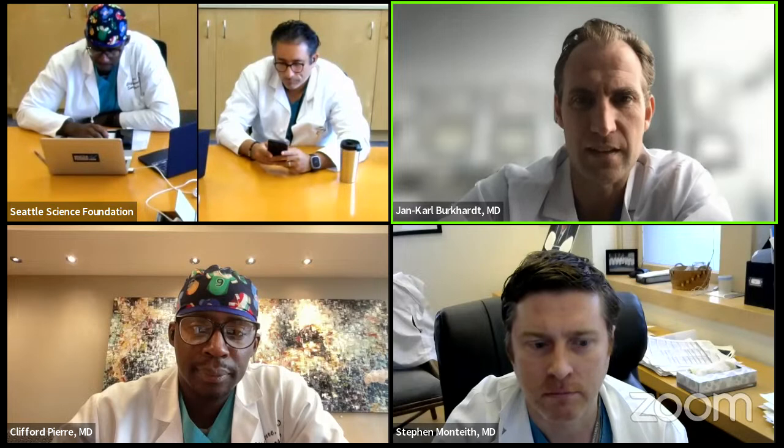For bypasses, sometimes if we don't have an A-line set up, I just put the sheath on a flush line of heparinized saline, and I let it drip very, very slowly. Some people even give heparin anyways during bypasses, so I think that's fine. I'm not super worried about the heparin necessarily, but we try to just use an A-line.